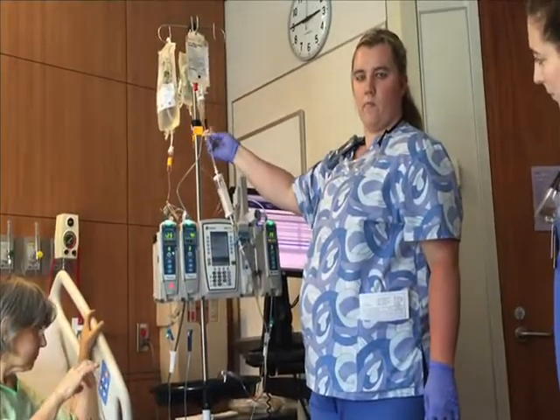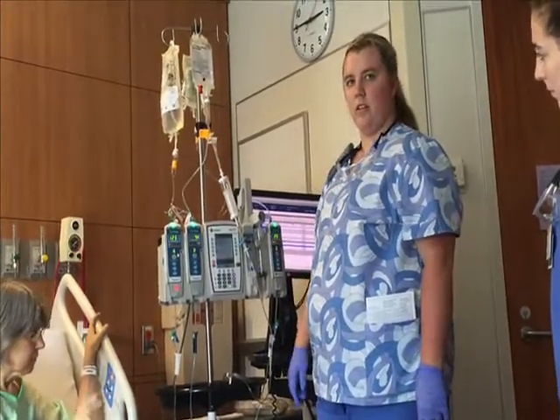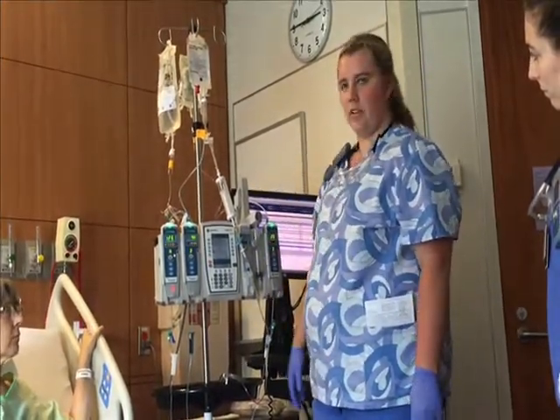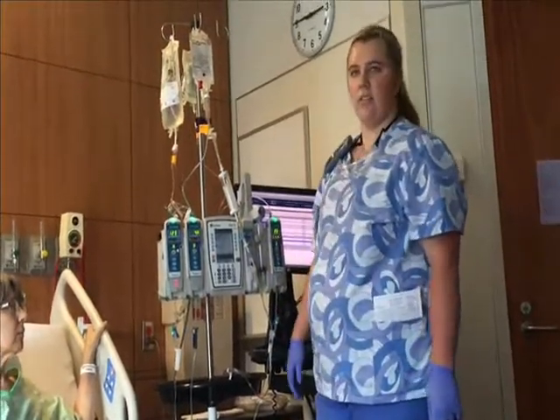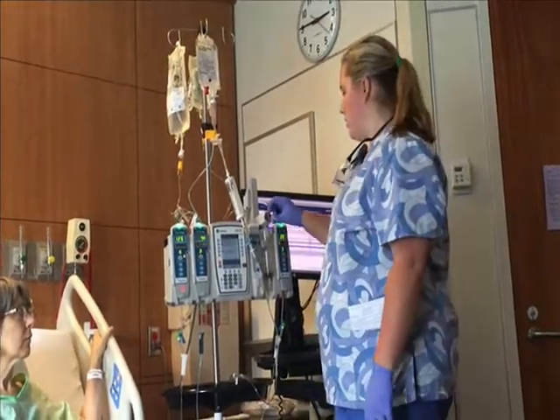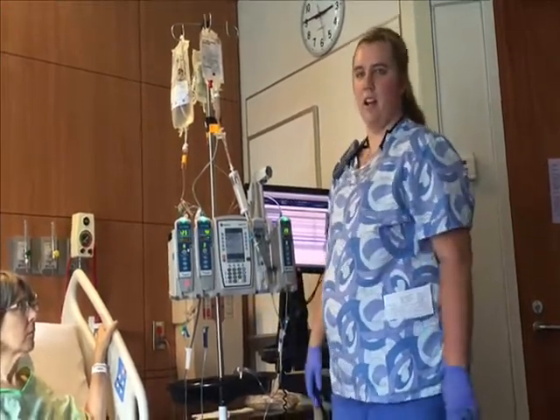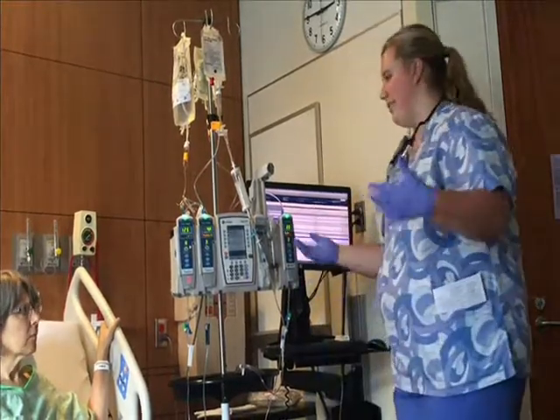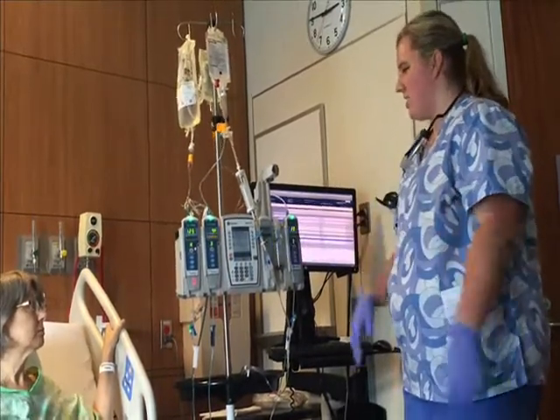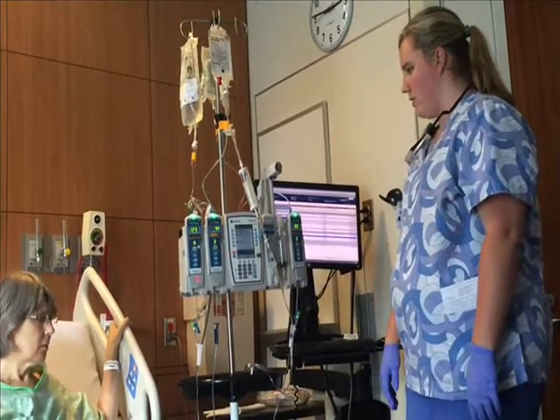You don't actually physically push it in there, do you? No, this guy does that for me. Oh, okay. I set the rate, and that's how it pushes it in. Is that super precise or something? Well, yeah, you have to set it for like 300, 200, whatever, and then set it accordingly. So if she starts feeling weird, then I'll usually do it slower. If she feels fine, then I'll do it a little bit faster. Is faster better if she's feeling okay? Yes. I mean, we prefer that she feels okay, but it's not uncommon that something might happen. You might feel weird. What do you mean? Like, some people just feel nauseous or whatever, but we don't plan on that because you got all the meds and stuff going, the pre-meds.